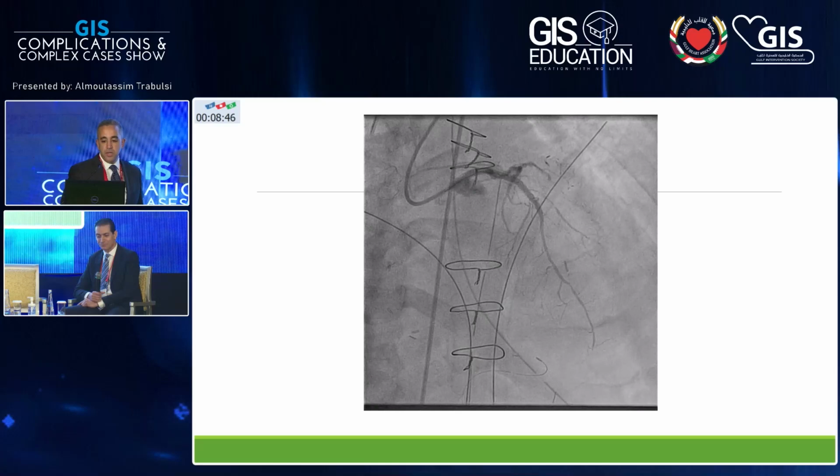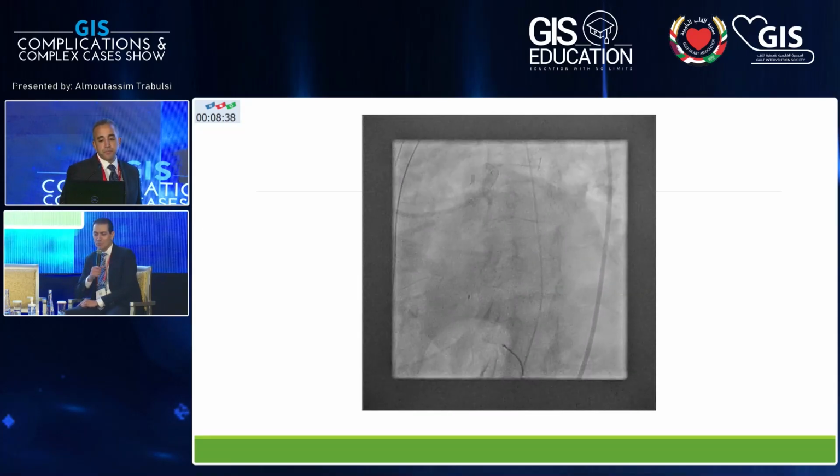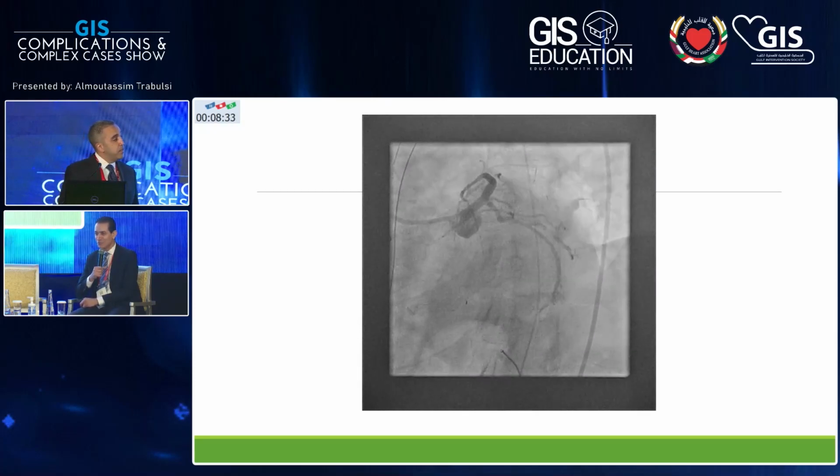And as you can see here, we got these excellent results. By the way, either the patient is on a very high dose of vasoactive support, or that's not a beautiful LAD. Yes, one of those.